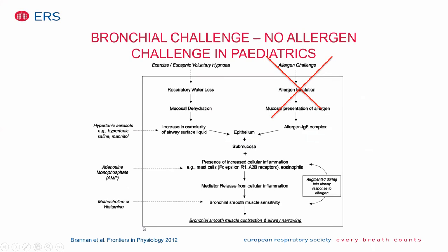These are just two examples of how to perform a bronchial challenge test. There are a number of other triggers which can be used, and you will find recommendations for further reading in the written summary you got, and in the more extended version of this talk. But one thing that I find very important is an allergen challenge should not be performed in children. This is not part of pediatric respiratory medicine, just the non-specific challenges.